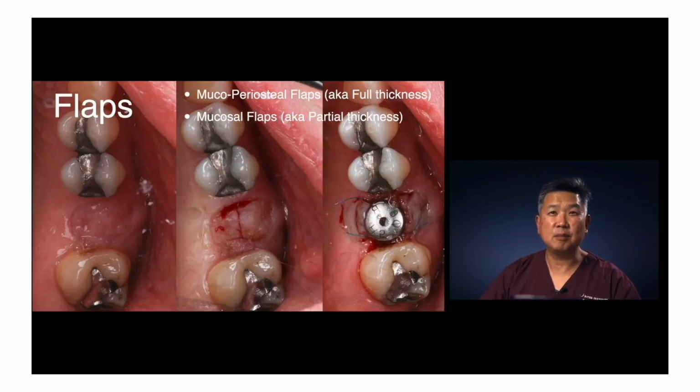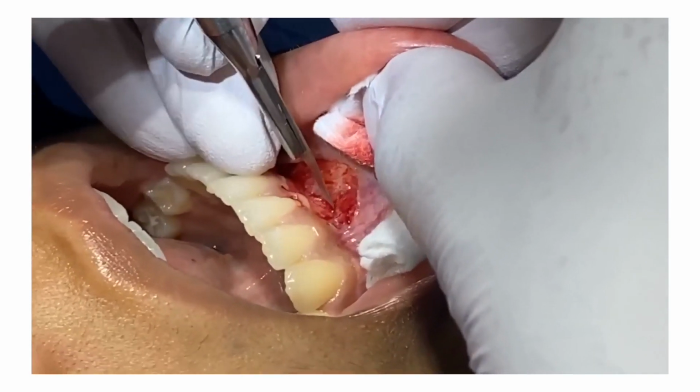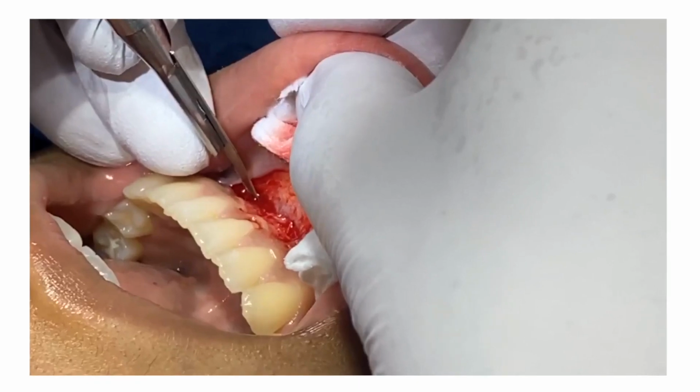You can actually have some really nice phenotypic results. And what's important is that he's not going all the way to the bone. He's leaving the periosteum underneath.